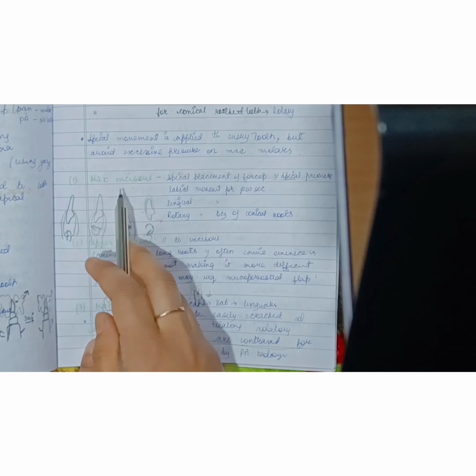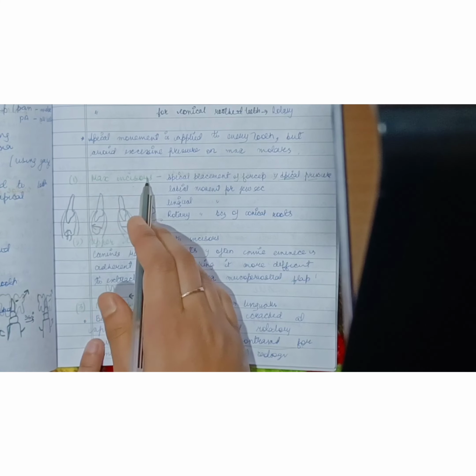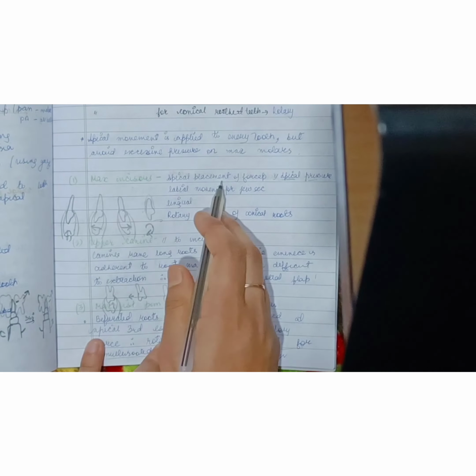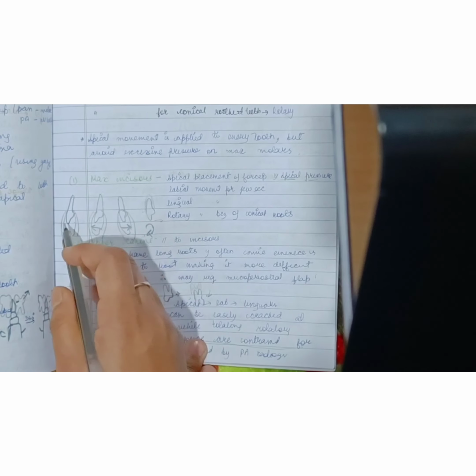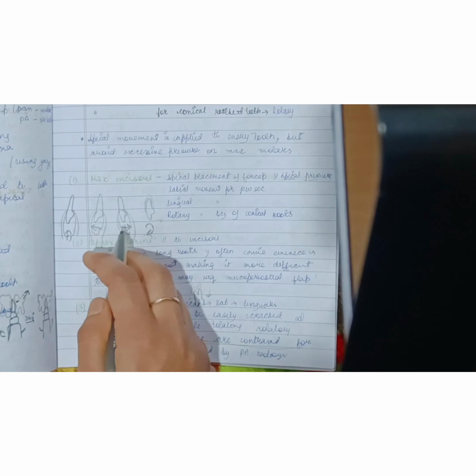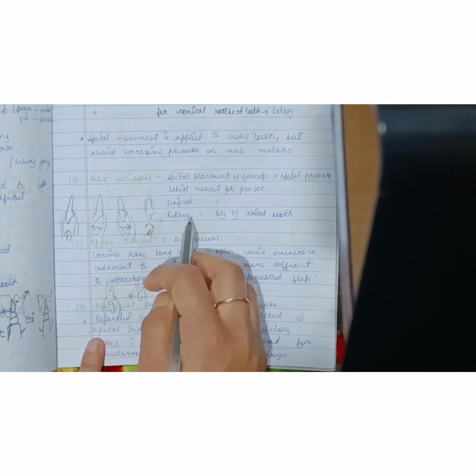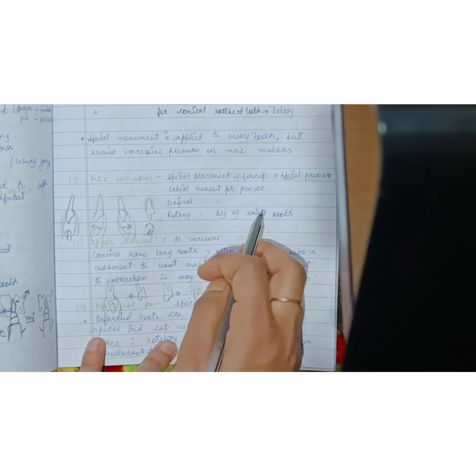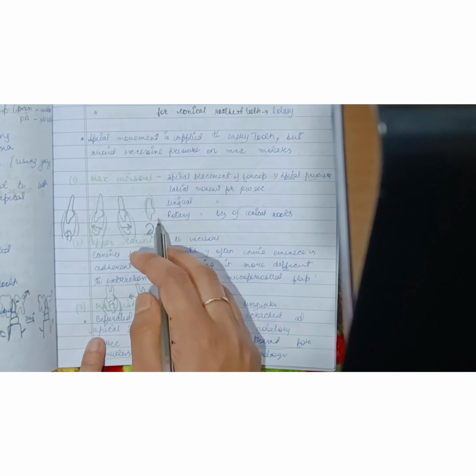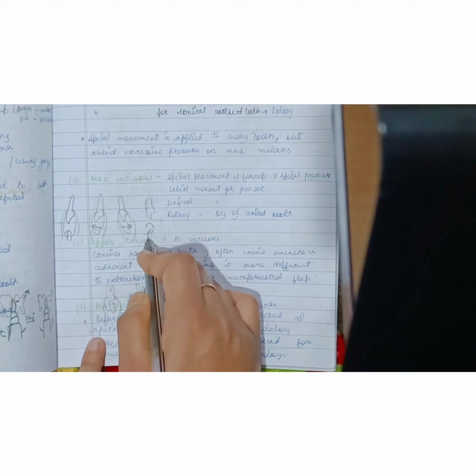Now coming on to the delivery of various teeth, first come the maxillary incisors. We use apical placement of the forceps and apical pressure. We place the forceps beaks below the CEJ and then apply apical pressure. Then we apply a labial movement for a few seconds, then lingual movement, and then rotary movement because its roots are conical. So rotary movement will facilitate the popping of the tooth out of the socket.